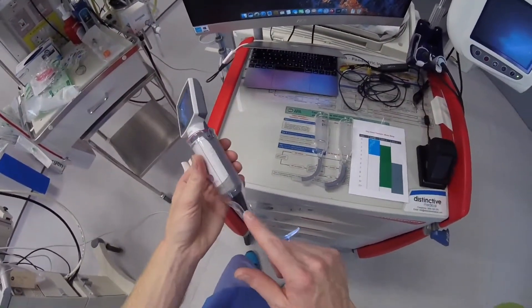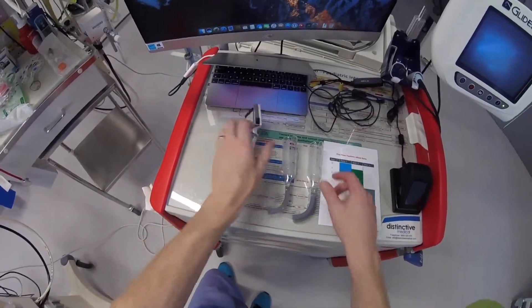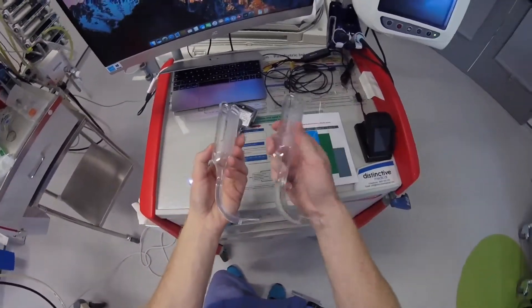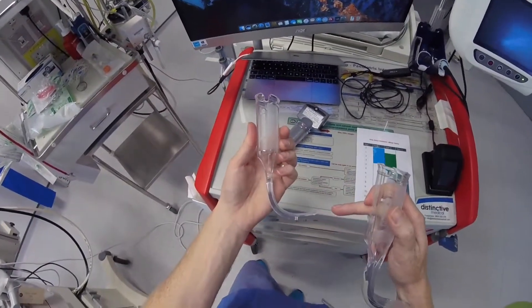The size 1 blade only comes in a non-channeled option, whereas the size 2 blade, you have the option of a channeled — which is this one — and non-channeled blades.